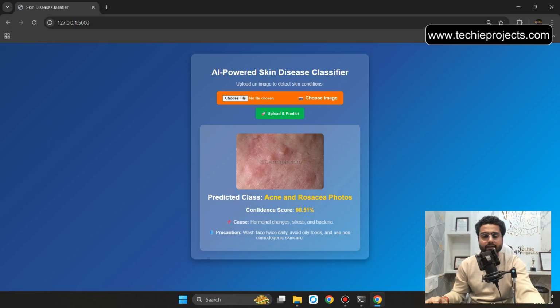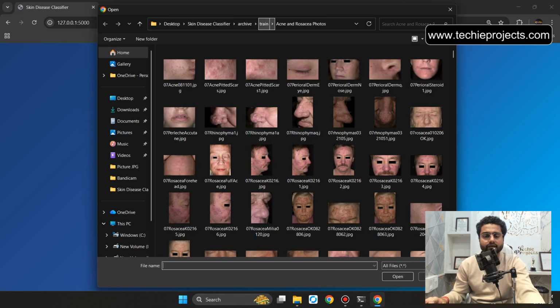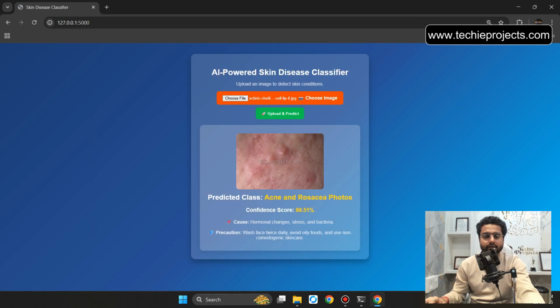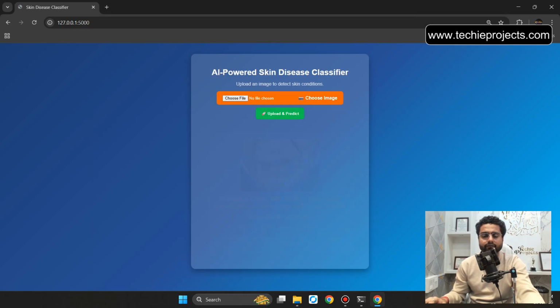That will predict the class acne and rosacea photos. Confidence score 98.51%. Cause: hormonal changes, stress and bacteria. Precaution: wash face twice daily, avoid oily foods, and use non-comedogenic skincare. Select any other file from different folder. Let's select this folder and select this image. Then click on upload and predict.